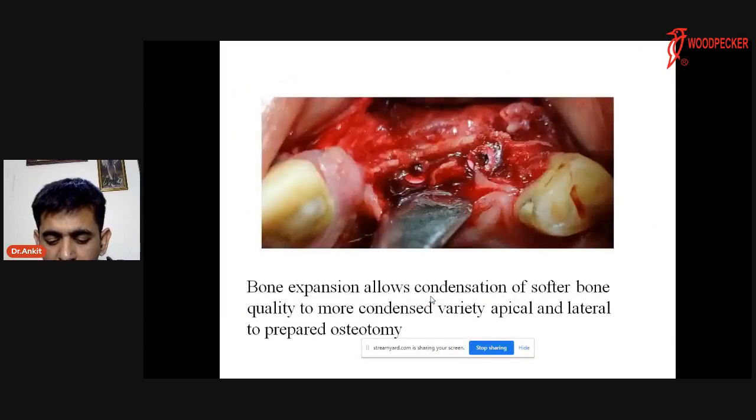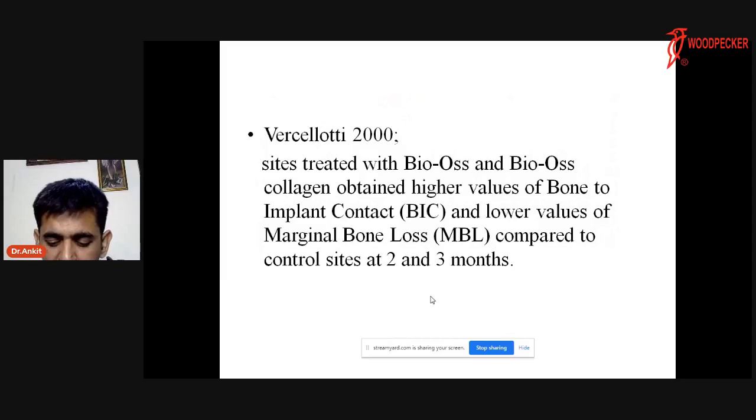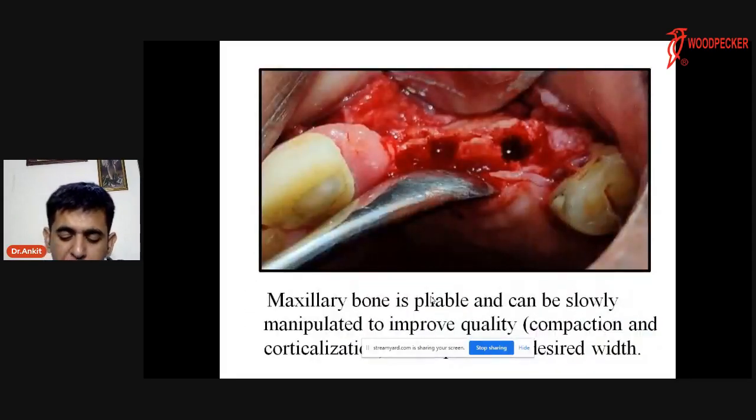There's a question from Krishnakant Pagwar. Sir has asked, when will you prefer the conventional burs over the denser bur after splitting? So I would say, whenever you feel that in and around the bone needs to be condensed and corticalized. You can see which I am showing you in this slide. Whenever we want that bone to be compact and corticalized, then in such cases you can use your densor.